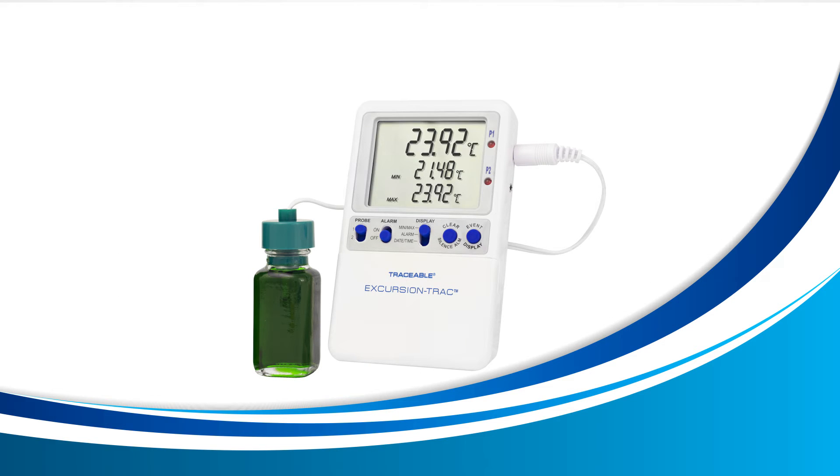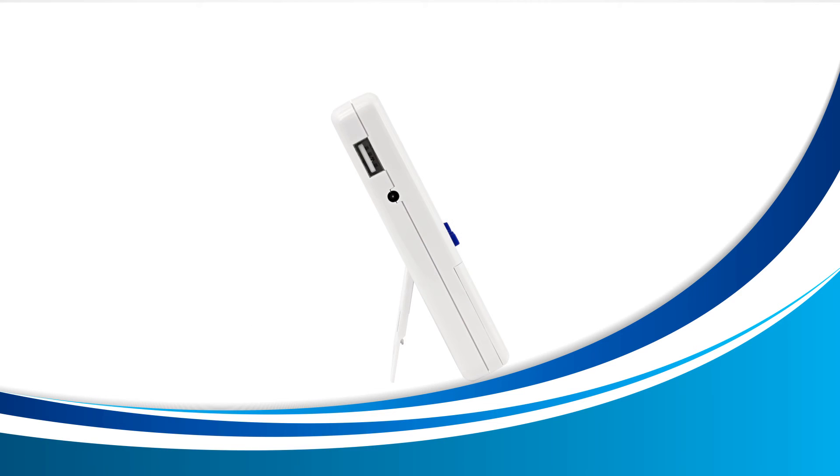Turn your unit to the right until you see this side. This small hole is where your AC adapter connects. Once you have your device connected to its AC adapter, we can now begin the transferring process.